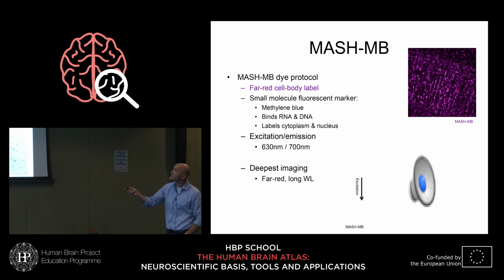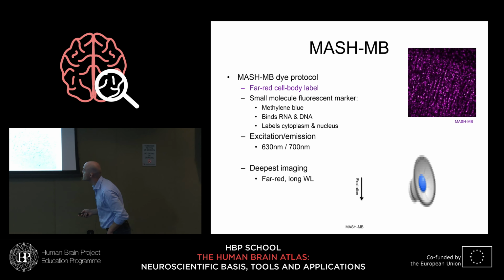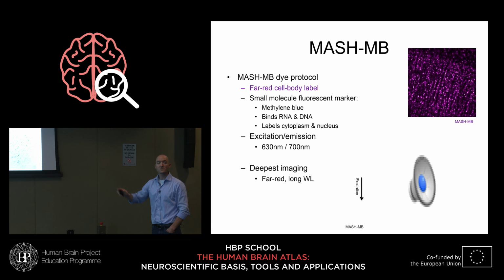The fact that these cells tend to be grouped into 20 to 50 to perhaps 100 micron thin microcolumns in layers 2 and 3. All of that cytoarchitecture is visible, and we can now analyze that in 3D. By now we're about 3 millimeters in, and this is quite an uncorrected image. The brightness starts to fall off a little bit, but we can still analyze all of this image.